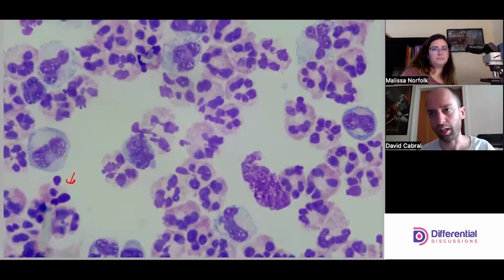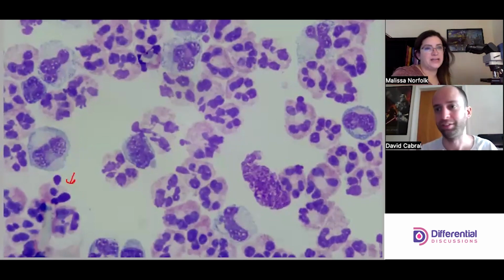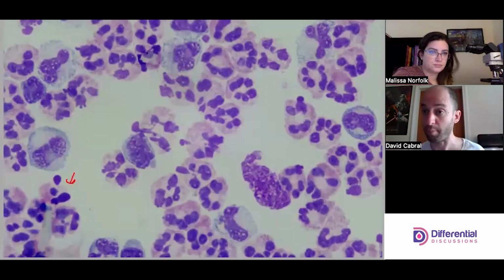That's just a necrotizing or a dying neutrophil. And when we look at the neutrophil lifespan in a joint space like this, especially during a pathology, they die very fast. They're totally not uncommon.